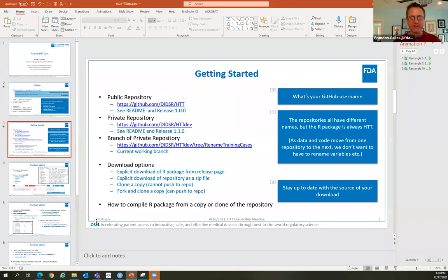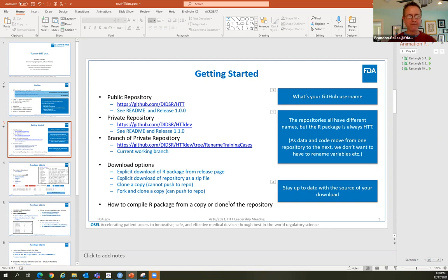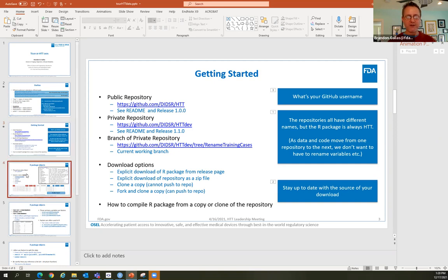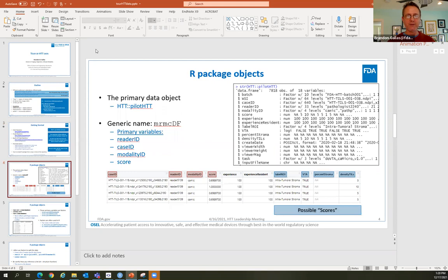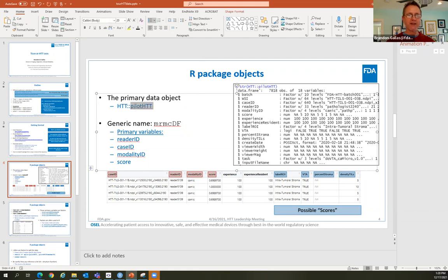The primary data object is the pilot_HTT data frame. I use the function str() on this object to see what it is — it's a data frame, which is like a table that allows for different data types like characters and numbers. There are 7,818 rows and 18 columns, with each column corresponding to a different variable type.